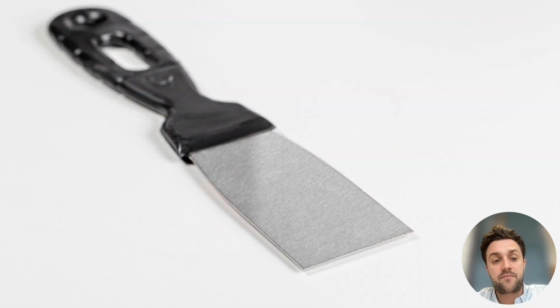The ultrasound probe itself, okay, so this is a wallpaper scraper, and it's quite a useful thing to think of ultrasound as. If you think of the probe as this handle and the beam as the blade, the beam comes out and it's extremely thin and it's a 2D picture, and it's up to us to utilize that 2D picture and make it into a 3D picture within our heads.